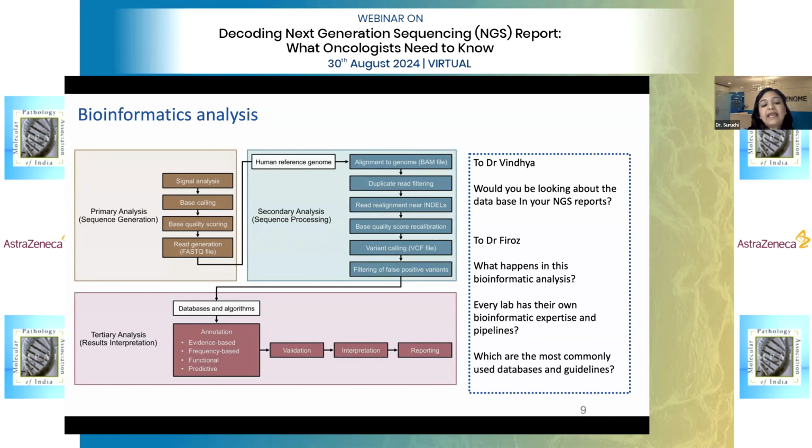Sir, in multiple indications, we have actionable variants which are quite well defined. If they are tier 1 variants classified according to AMP guidelines, then there is no issue. But if there are tier 2 or tier 3 variants, and we do not have any tier 1 variant on that report, and we don't know how to use those next generation sequencing results, some tier 2 off-label variants or tier 3 variants, in those cases, yes, we can look at certain literature and databases to understand the pathways, or to understand how those variants would behave.